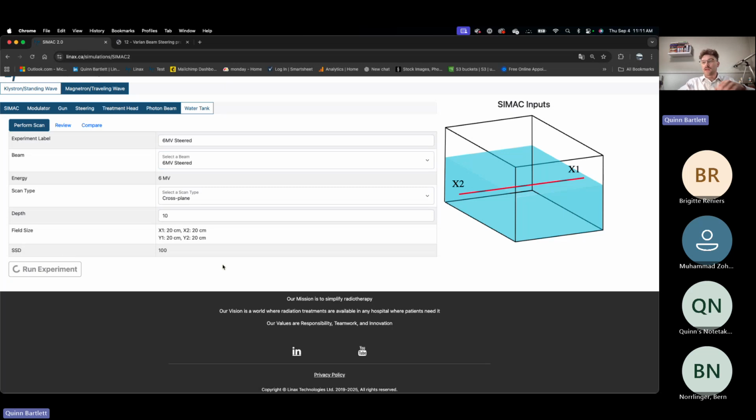And so again, cross plane, same distance, same depth, I should say. And we'll get this, and then I'll just quickly throw them up on the compare. And then that's essentially what we have for our beam steering.